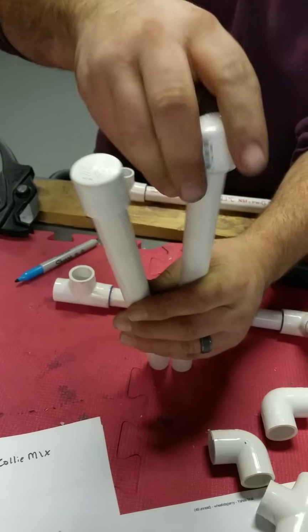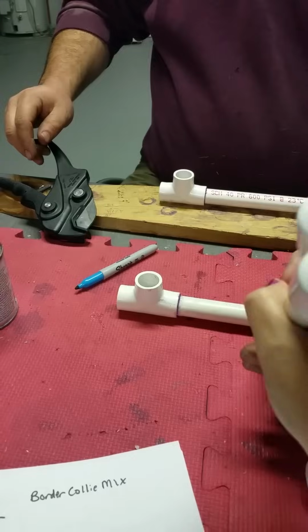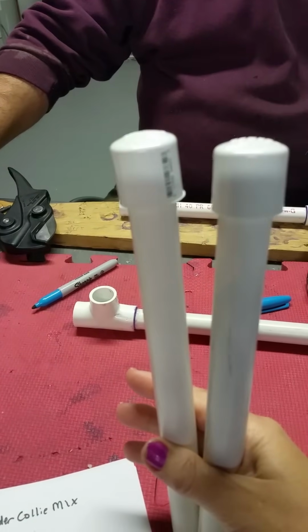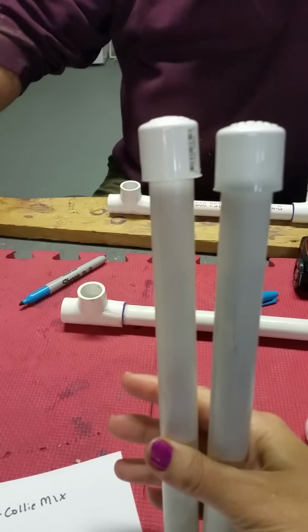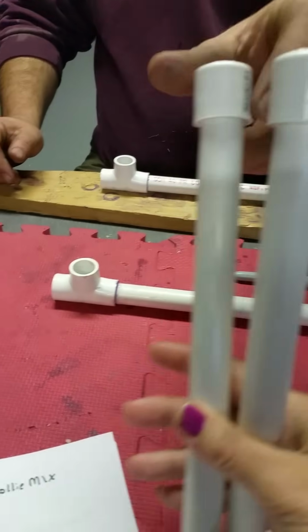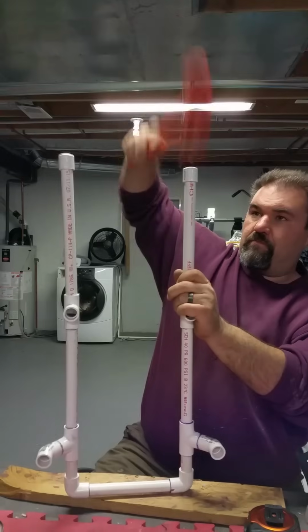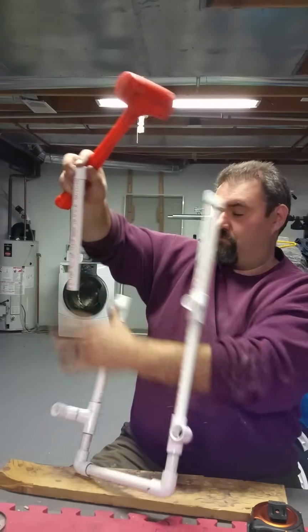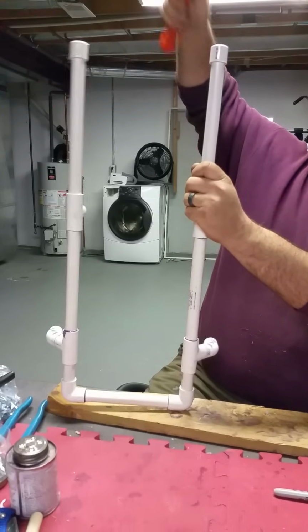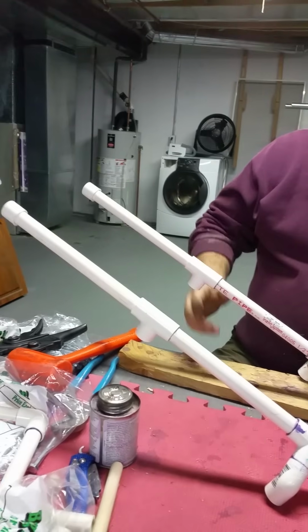These are just little safety caps that make it so the cart doesn't catch on your furniture, and it has a nice, you know, finished look to it. And we just slide those on. We don't usually glue them, and then we'll pound them in with the mallet. You want to pound them both in equally far so the cart is equal in length.